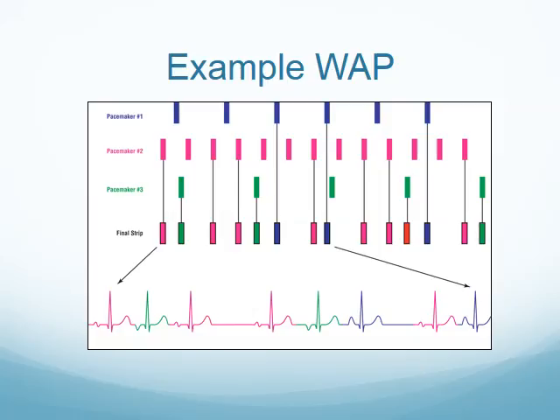So here in our example, pacemaker 1 is our regular pacemaker, so to speak. We have 3 different pacemaker sites. They're all providing stimulus, so they are kind of occurring at different times as they all try and work their way down. Look at some examples of what this is actually going to look like here. You do see that we have a pretty irregular rhythm here with all our different morphologies of P waves.